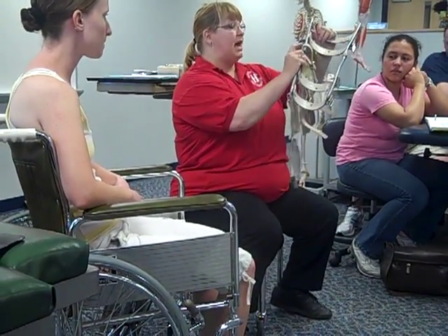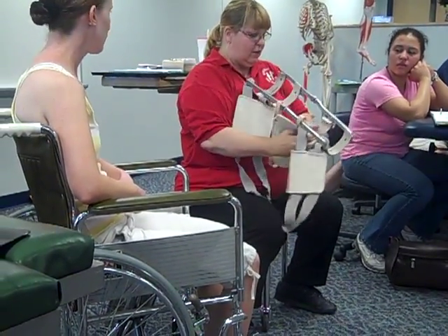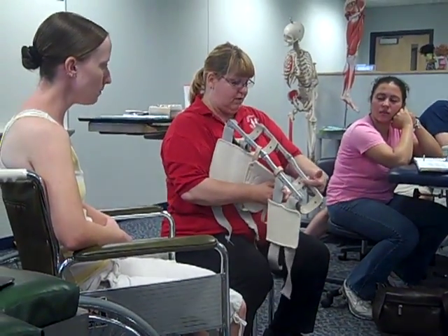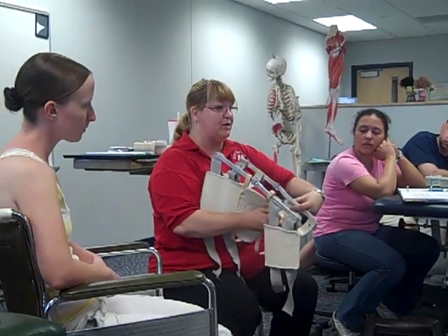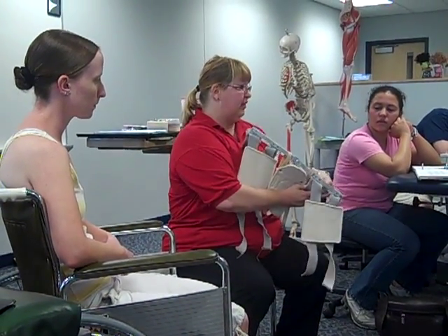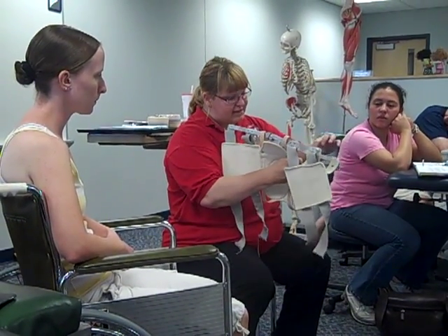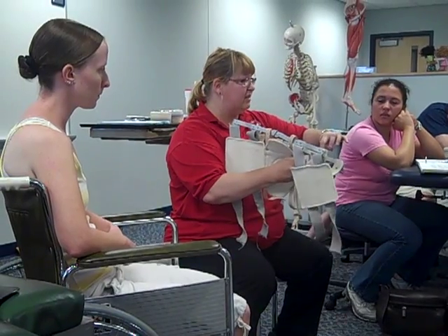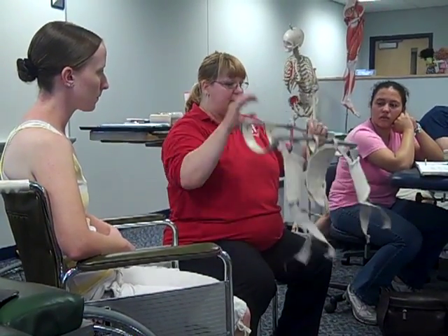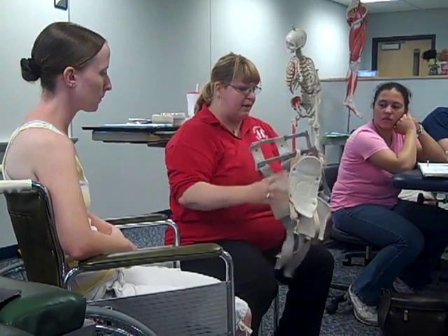There are drop locks on both sides. This one is getting a little old — one of the straps bends in, so make sure once you get it on the patient that you straighten it up so it's not bent under. It's riveted, so it can't be easily fixed. We're going to put this on the patient — first thing is to put it underneath the patient's lower extremity.